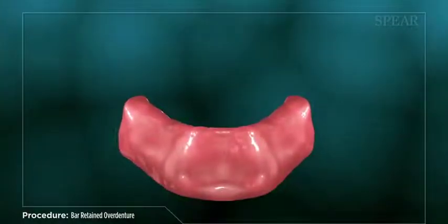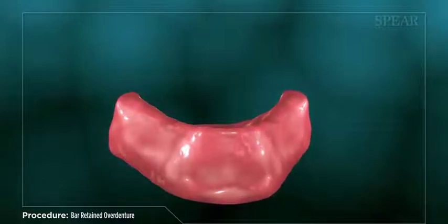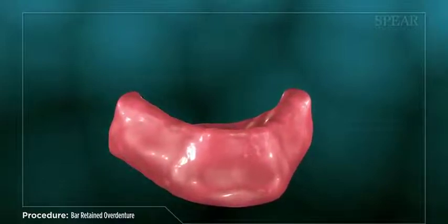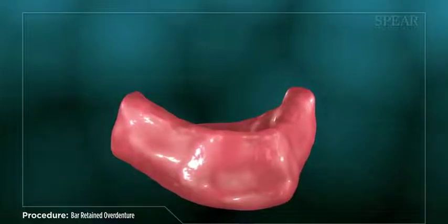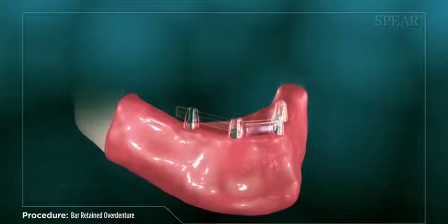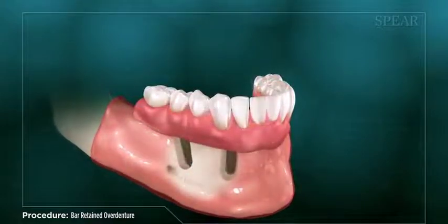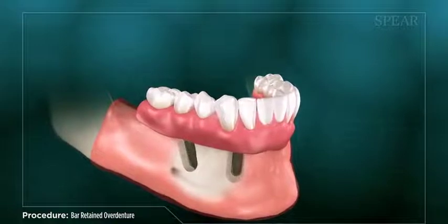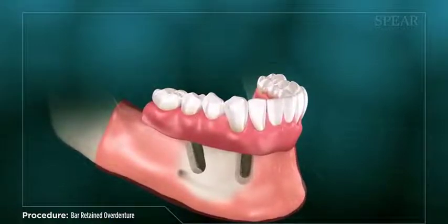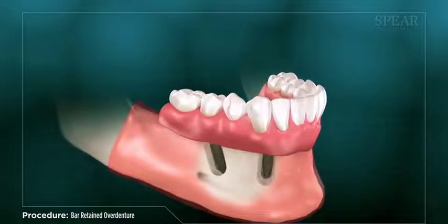For patients requiring replacement of all teeth in the upper and/or lower arch of the mouth, a bar retained overdenture with dental implants is an excellent treatment option. An overdenture improves your appearance by replacing your missing teeth, while providing improved overall function for eating and speech, combining the stability provided by dental implants with the convenience of a removable denture.